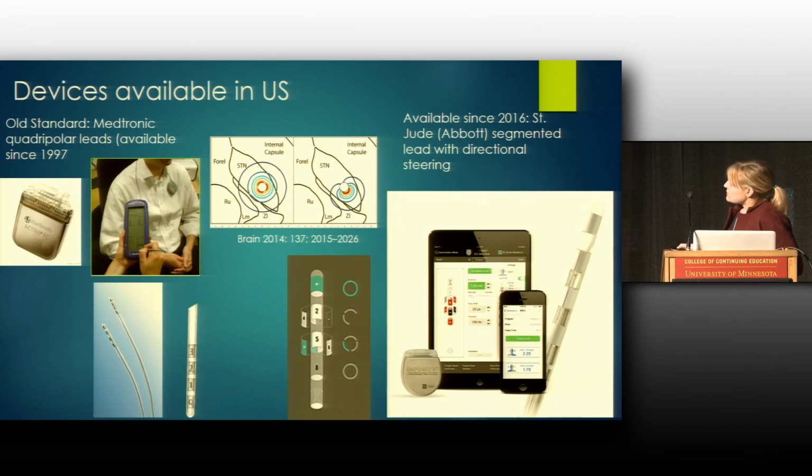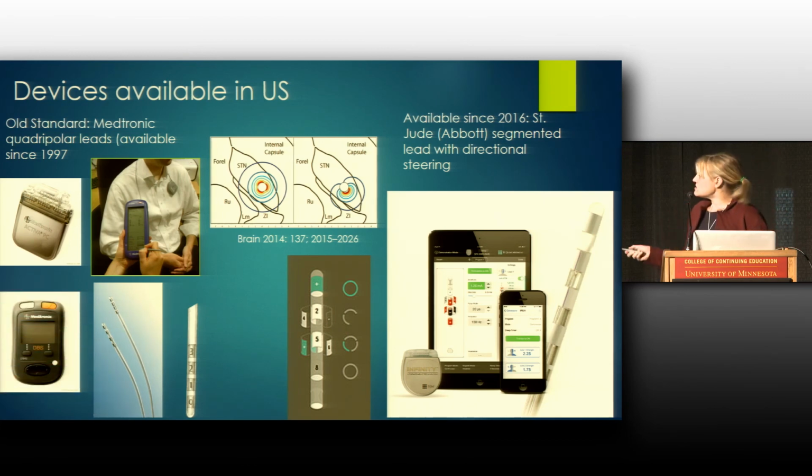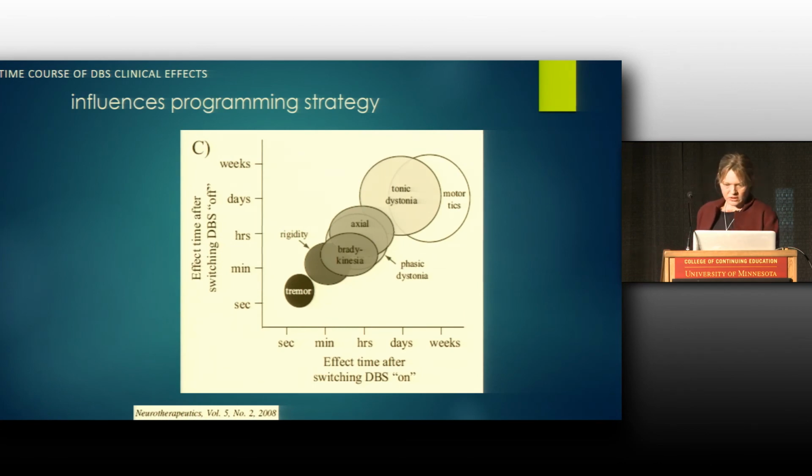So here's an example of this in practice. So here's the typical one where you have it around. Here, you can push it in one direction. And the idea is that what we can do is reduce the amount of likelihood of side effects and that sort of thing. And this one they're pretty excited about. It's iPad. This is my programmer, is an actual iPad, and then you get an iPod as the patient. So it's kind of wild. This is the remote control for the thing.